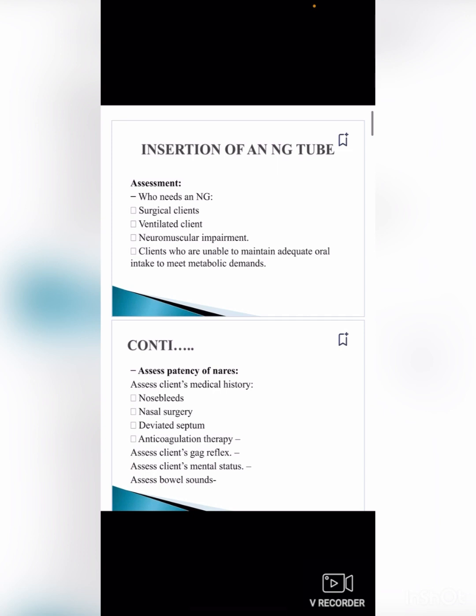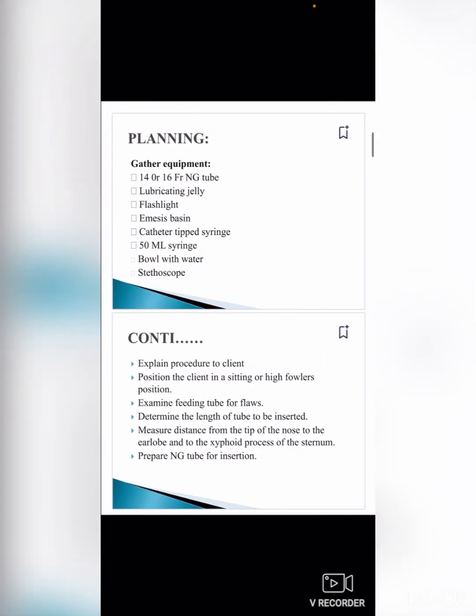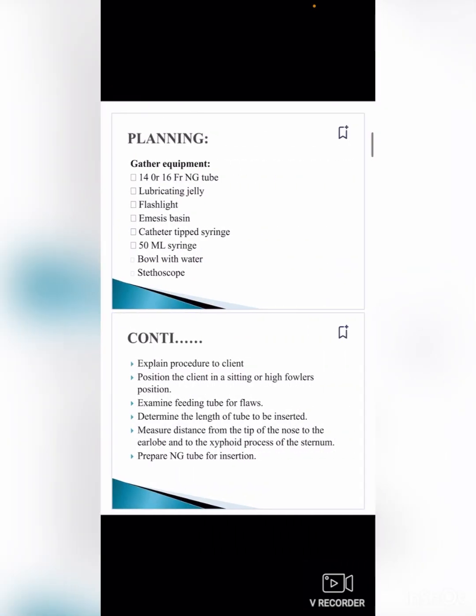Also assess for deviated septum and anticoagulation therapy. Assess the client's gag reflex and mental status. For planning, gather equipment: a 14 to 16 French NG tube, lubricating jelly, flashlight, emesis basin, catheter-tipped 50 ml syringe, bowl with water, and stethoscope. Explain the procedure to the client.